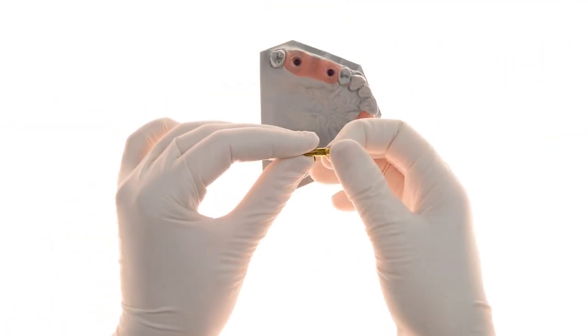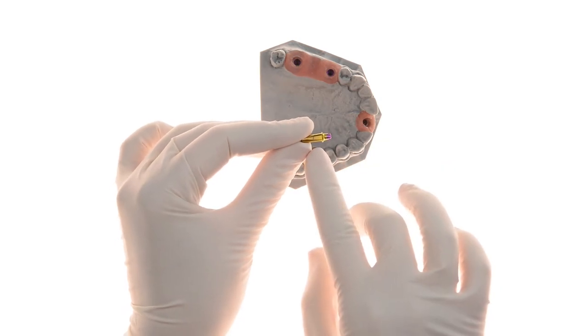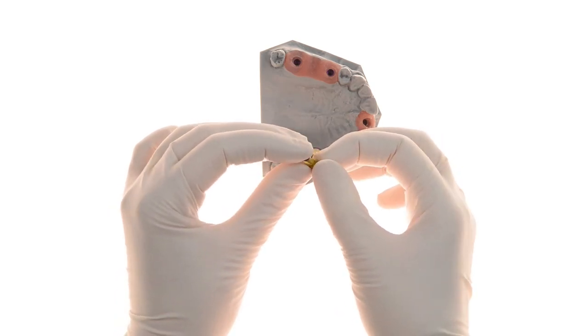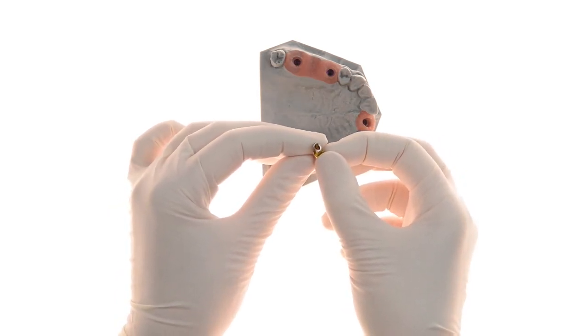For the adjustable EasyBase, the 10mm pillar may be customized to the desired length. Here you can see the EasyBase post adjustment. Once customized, the adjustable EasyBase is directly scanned.